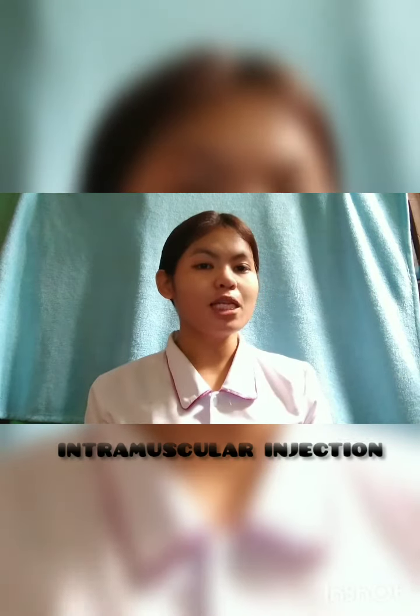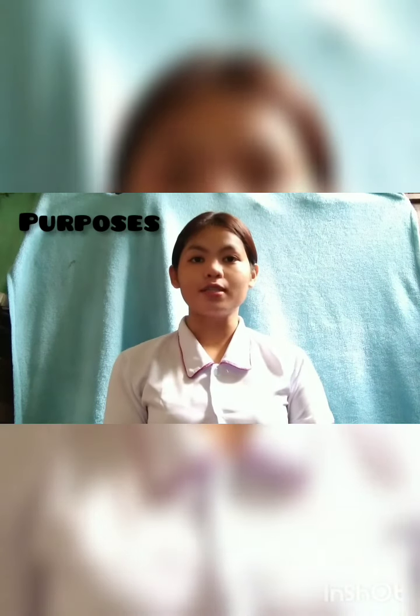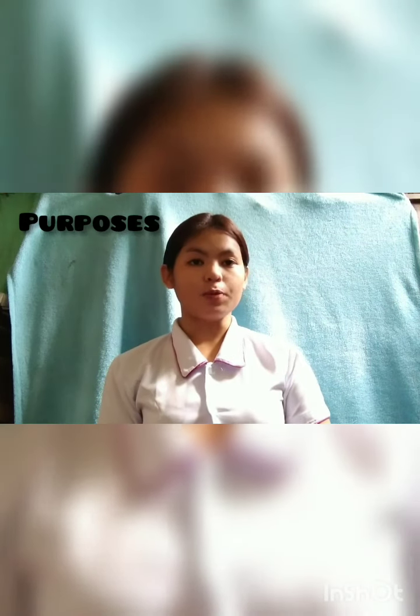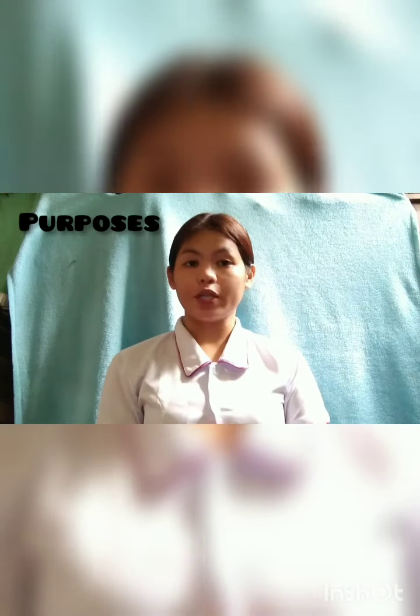For this video, I will be demonstrating to you how to administer intramuscular injection. Intramuscular injection route deposits medication into deep muscle tissue which has a rich blood supply, allowing medication to absorb faster than by subcutaneous route. The purpose of intramuscular injection is first, the less painful administration of irritating drugs, and to allow more rapid absorption of the drug compared to subcutaneous route.